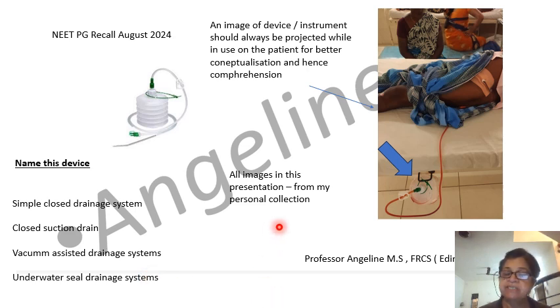And all the images in this presentation are from my personal collection. You can see the same drain here. When you see it as a photograph in isolation, everything will be clear about it. But when you see it in a clinical setting, you may not be able to see all the details. And personally, I feel an image or device or an instrument should always be projected while in use on the patient for better conceptualization and hence comprehension.